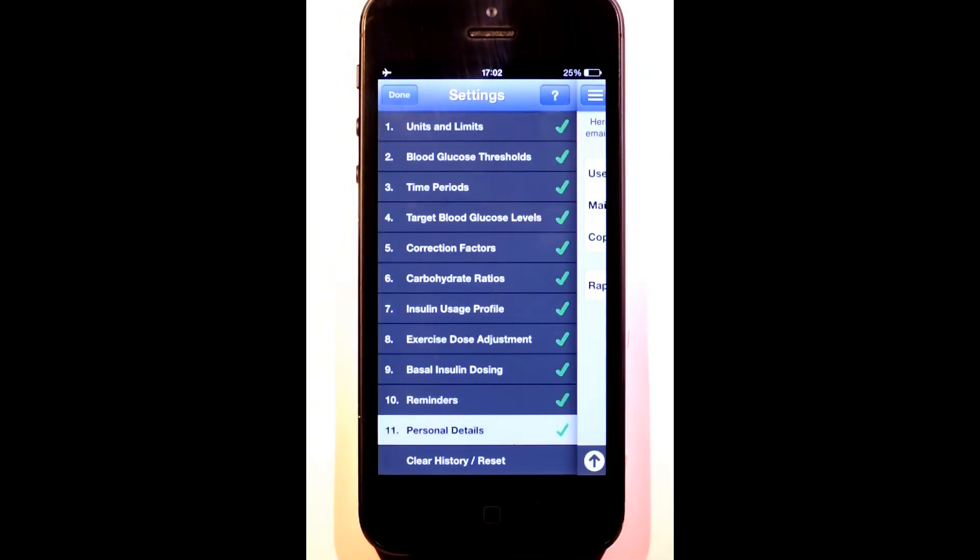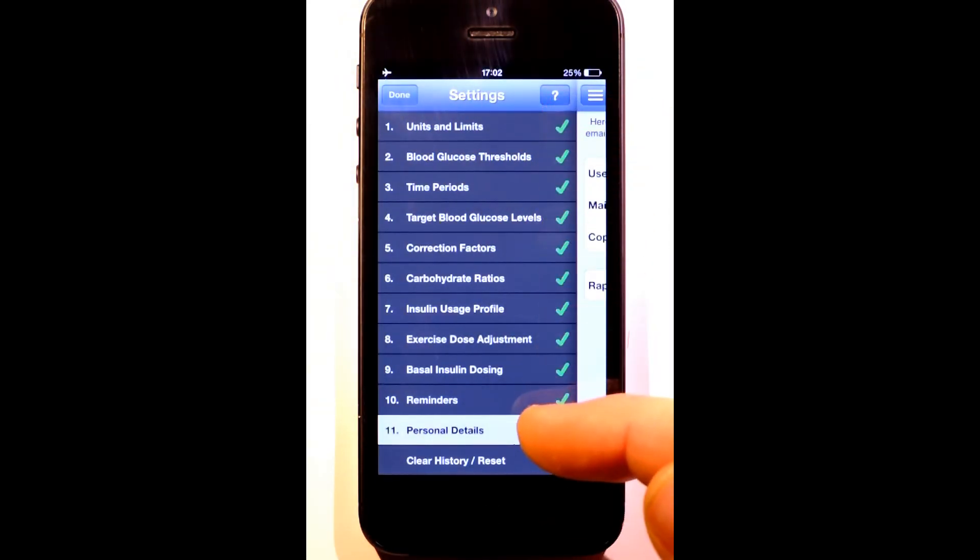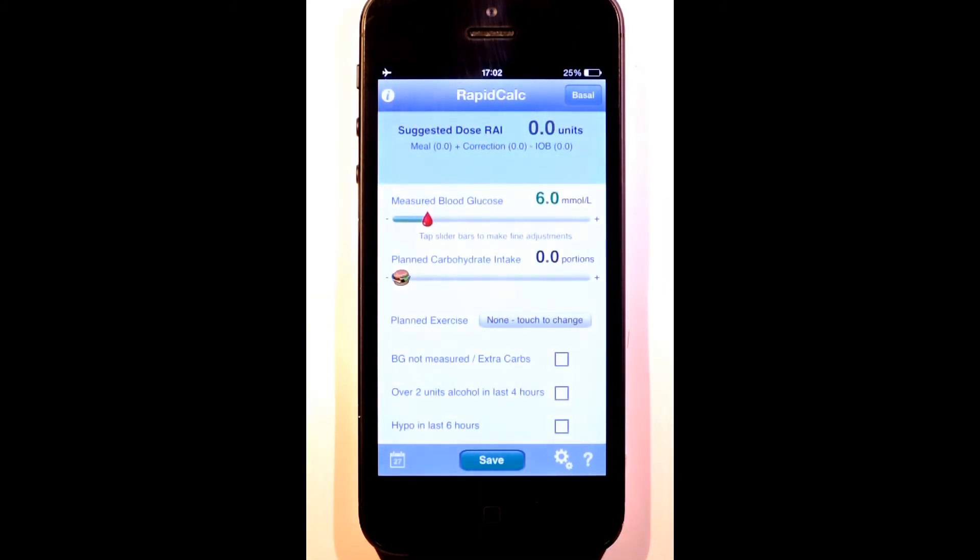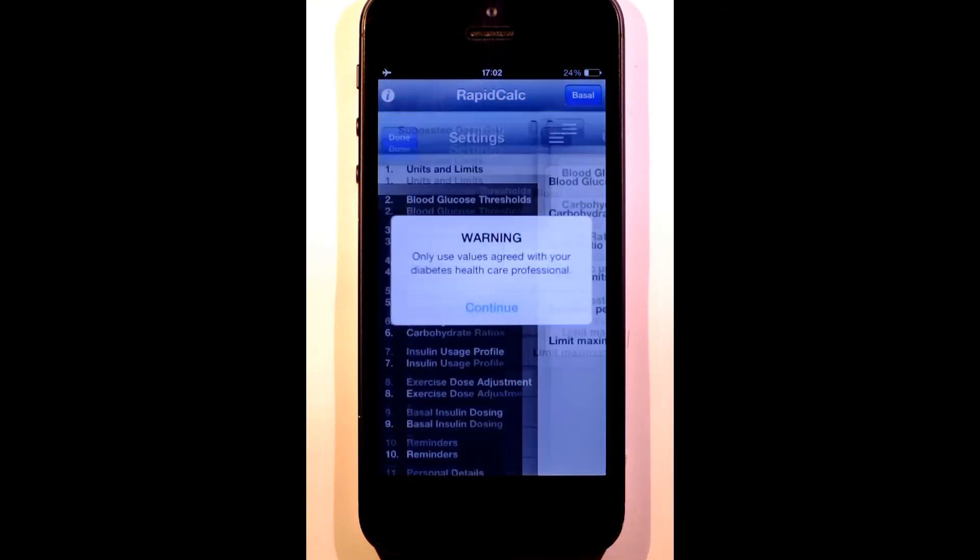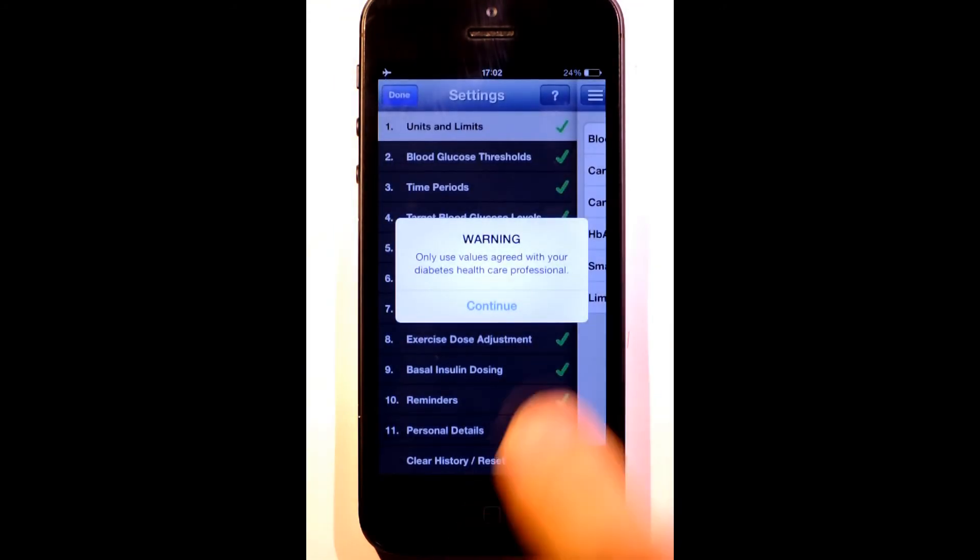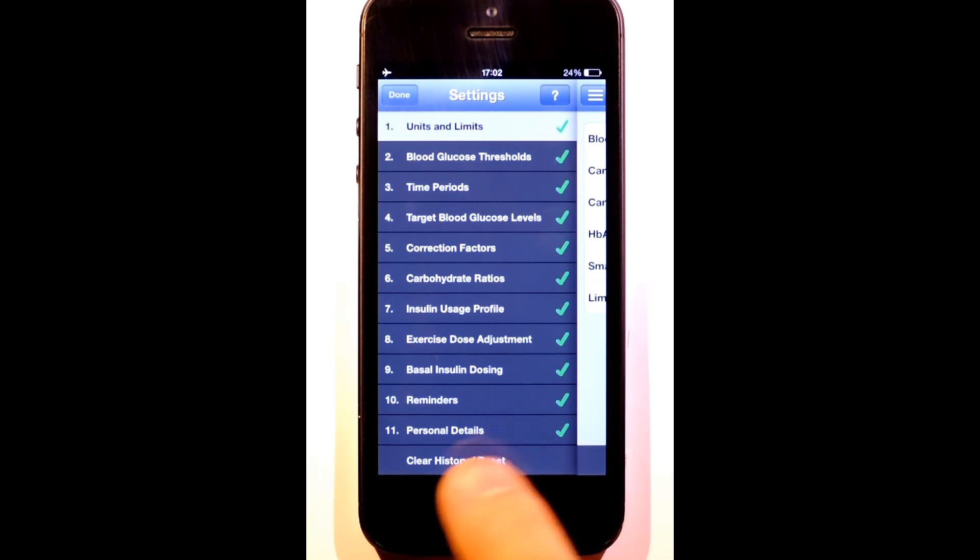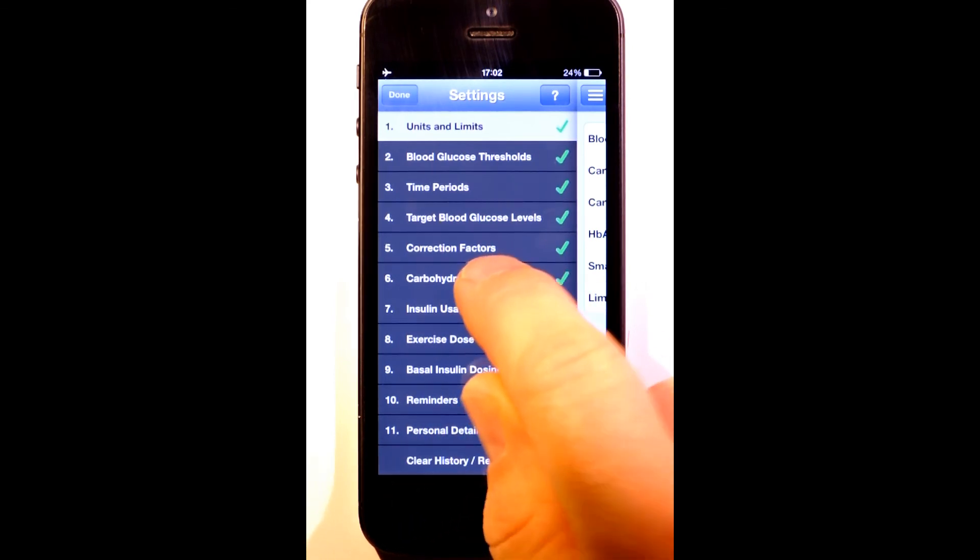All of our settings are now ticked, and RapidCalc is ready to use. If I want to edit a setting, I can tap the appropriate section to go to it directly.